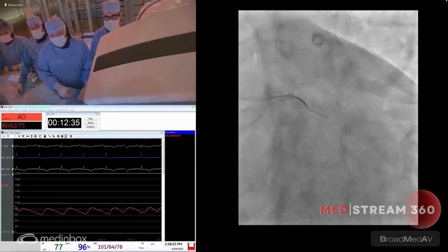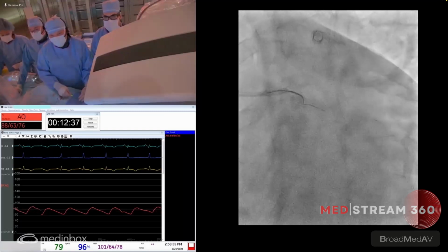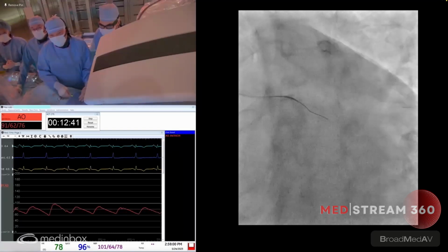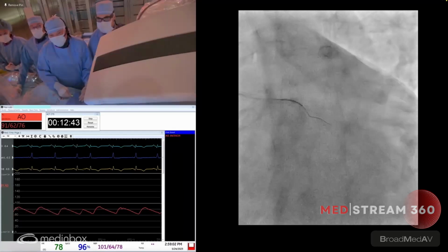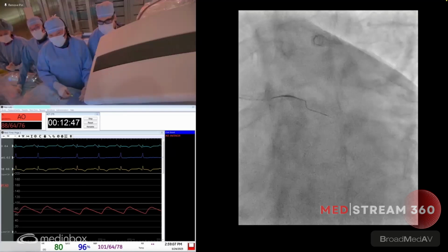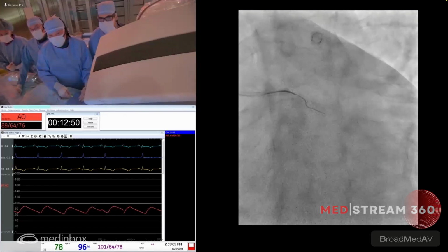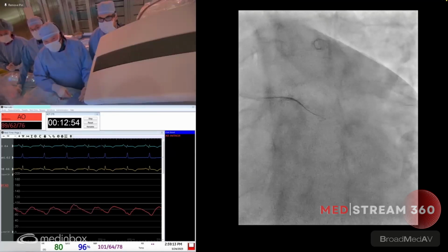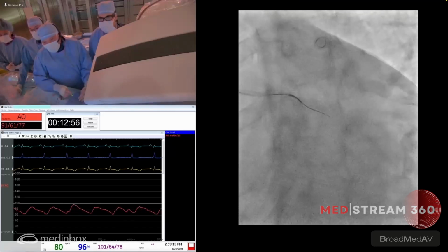I'm impressed by the good result of the stent in the LAD by IVUS. So the role of imaging, I think, is key in some cases. Now it's more like a CTO approach, going stepwise, antegrade with the microcatheter, different wires, being careful, taking our time to really cross that. We're almost there, but there's still a lot of work to do.